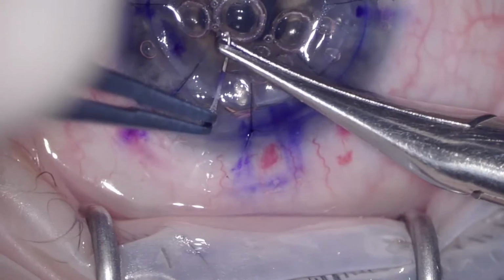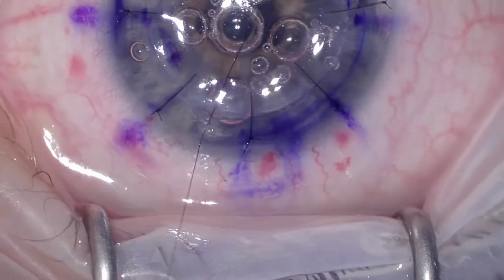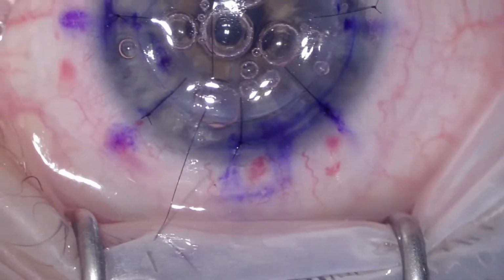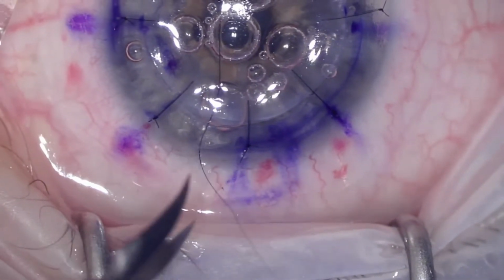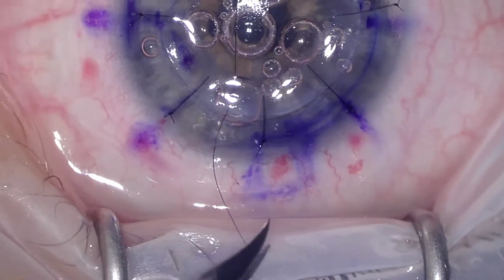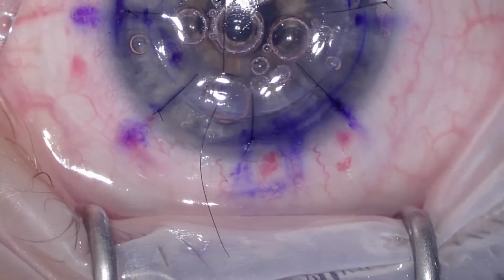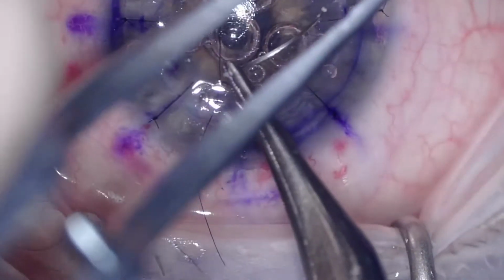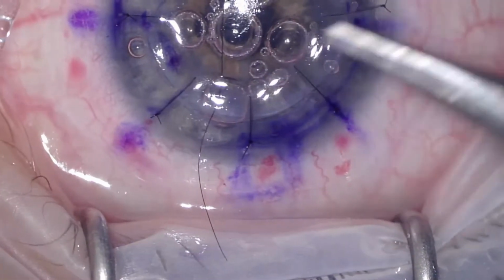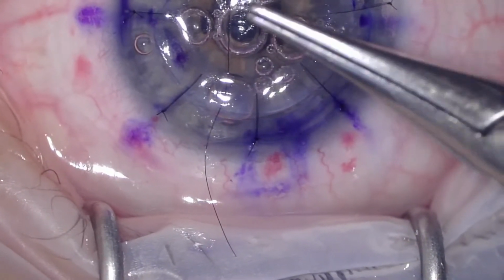Now here, I'm zooming into this suture because I think this was the point when I managed to get a tiny little perforation on the Descemet's. So when I completed the sutures, I decided then to put a little bit of an air bubble inside the AC just to maintain the apposition of the Descemet's with the host, with the donor cornea. This is important to do when you're suspecting but not confirmed a slight perforation of the Descemet's.